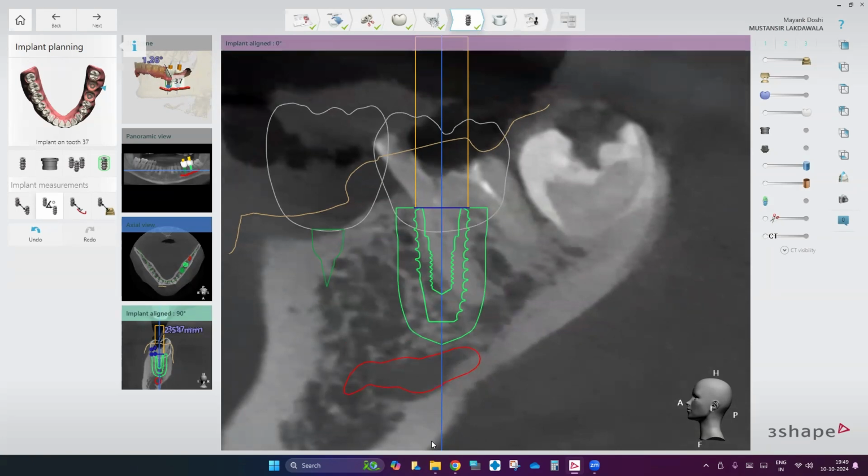Yes, sir. Oh, very good. I didn't realize a lot of people joined, almost everyone. Excellent. So, Dr. Deepika, were you there? Y'all can unmute the mic if you don't have a disturbance in your background. Dr. Deepika, did you see when I changed the arc or adjusted the arc of the scan? Dr. Dipali.